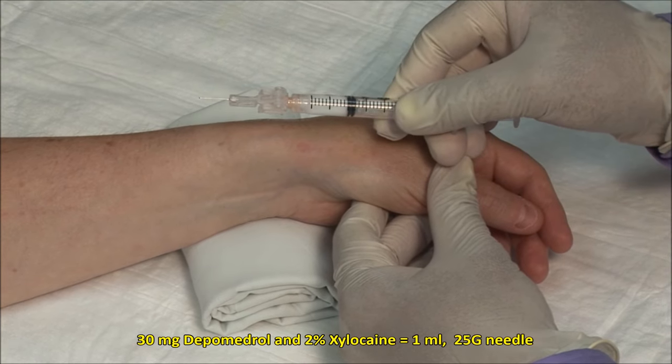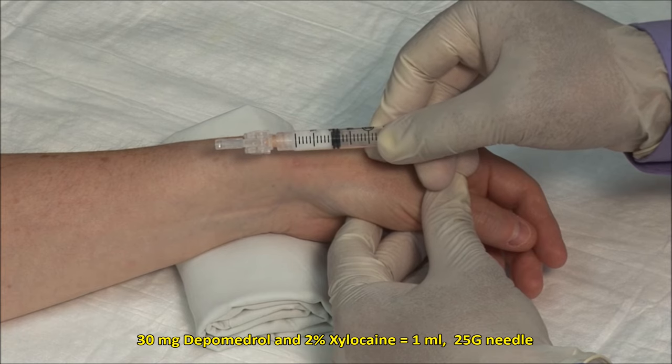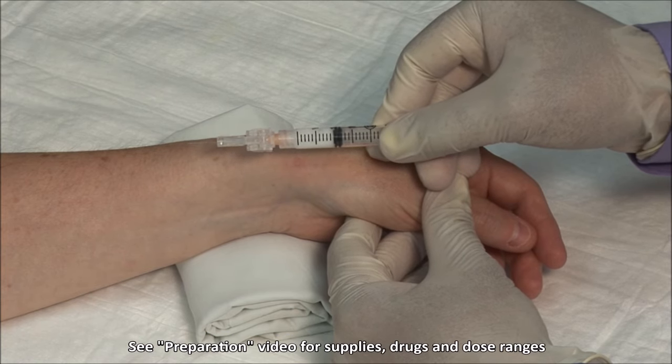I have a 25 gauge 5/8 inch needle and a mixture of 30 mg of depo-medrol with 2% xylocaine, mixed to a volume of 1 mL.